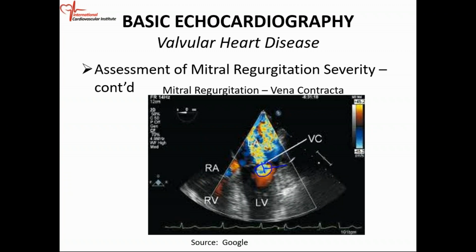So radius r, and the velocity on this surface is actually the aliasing velocity. If you look closely here, you see a velocity which is, I think, minus 45.2 centimeters per second. So that is the velocity on the surface right here. And then all of this down here is the regurgitation.